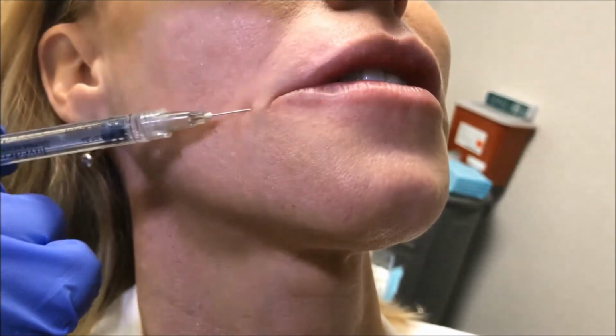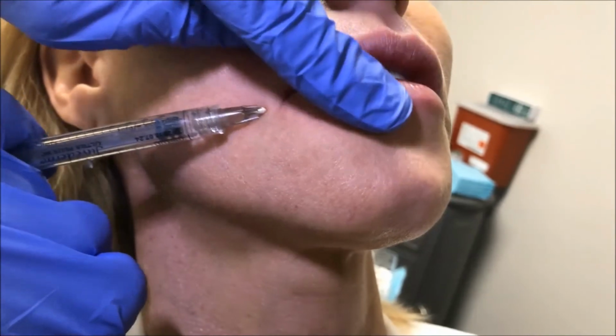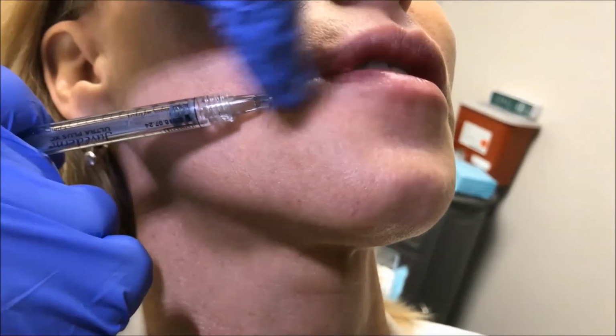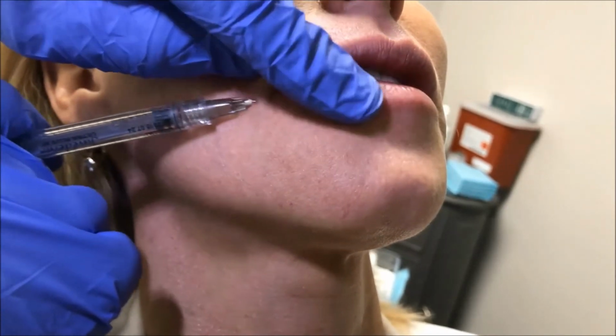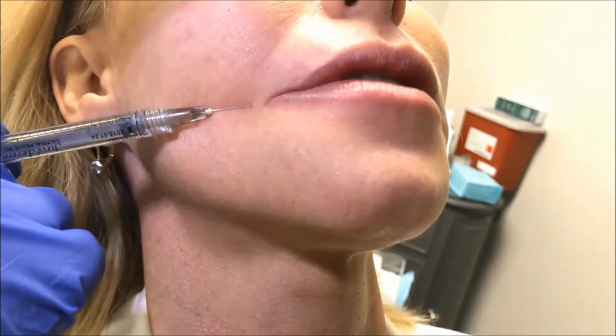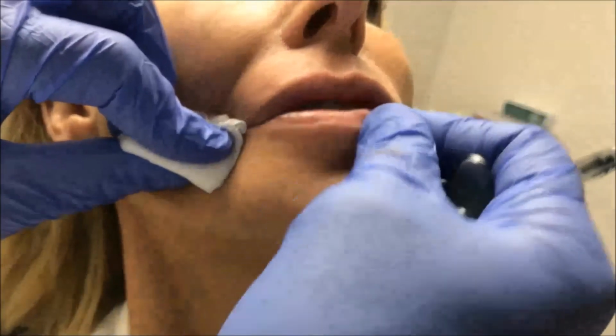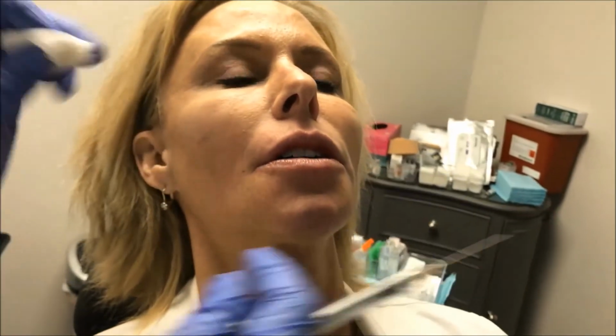You can just kind of see the lip filling out in those vertical lines, softening with this technique, and it takes a tiny bit of filler. This lower lip, I'm doing about 0.1 total, so it's not a lot of filler. And remember, this is a 50-50 blend, so some of that is going to go away just when the lidocaine absorbs. Good.